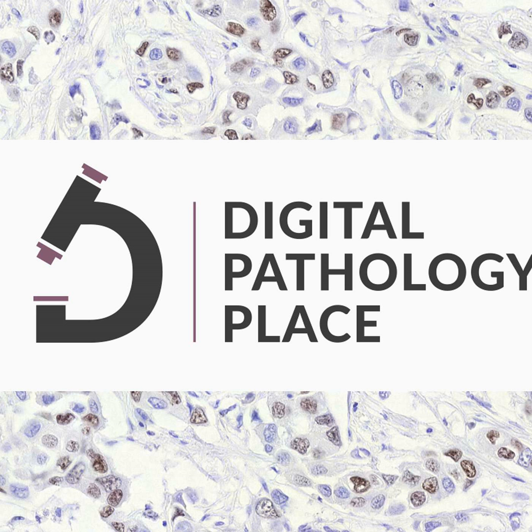Yeah, well, I think it's a good analogy, the whole slide imaging analogy you just made. Essentially an AI can't structure data that's not there, right? So first of all, I think that process of synoptic reporting has been really beneficial to ensure completeness. If the data is not in the report, if it was just left out, you can't structure that. So that's one issue. No data, you cannot structure it. And so that's one reason to start with a structured process, which oftentimes is an easier way to enter data, checking a few boxes, and so forth. So, what was the second part of your question? I don't remember now. Sorry.